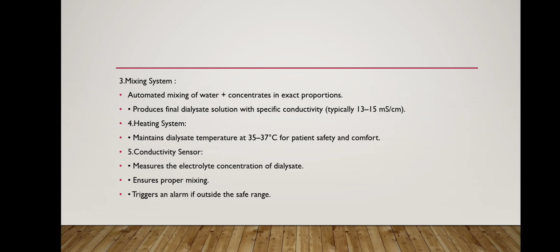Then the heating system maintains the dialysate temperature at 35 to 37 degrees for patient safety and comfort.